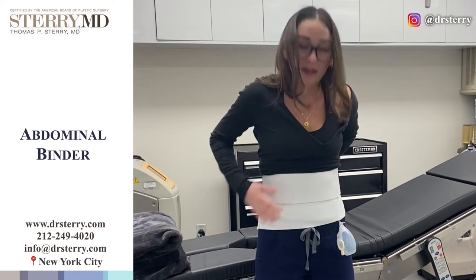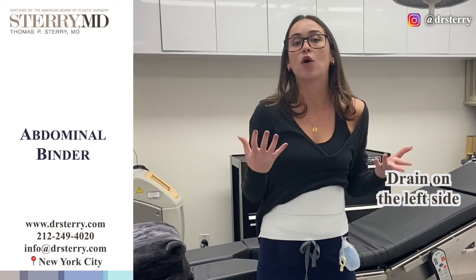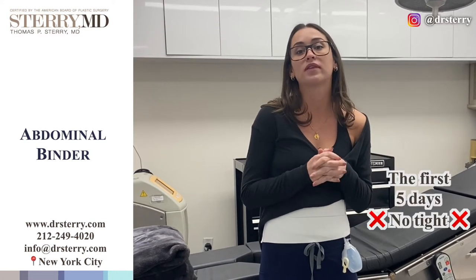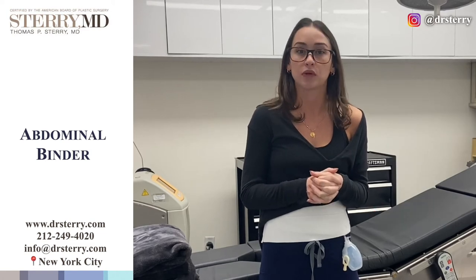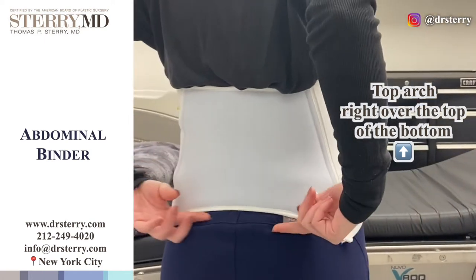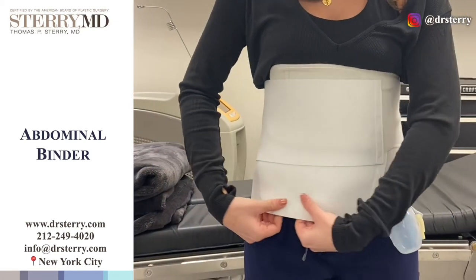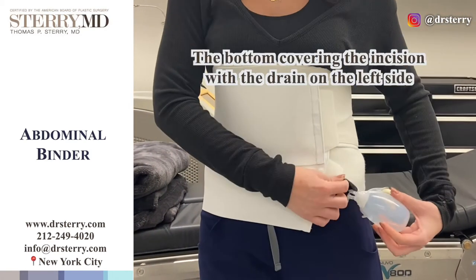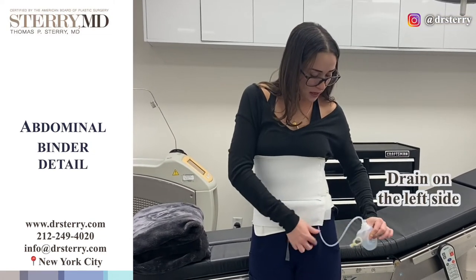When you wake up and when you leave the office, you will be in an abdominal binder that looks like this, and the drain will be coming from the left side. In terms of how do I know that I'm wearing this tight enough — the first five days while the drain is in, you actually don't want this to be tight. You kind of just want it as a placeholder. You want this top arch to be right over the top of the bum and then everything is wrapped around, ensuring that the bottom is covering your incision with the drain coming out of the left side.